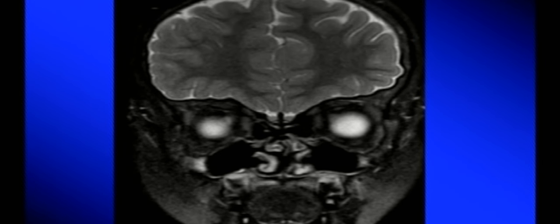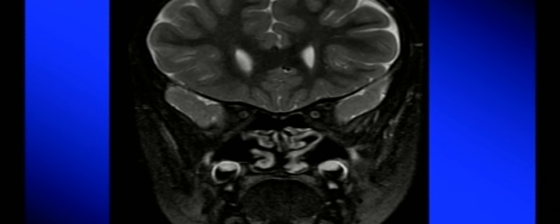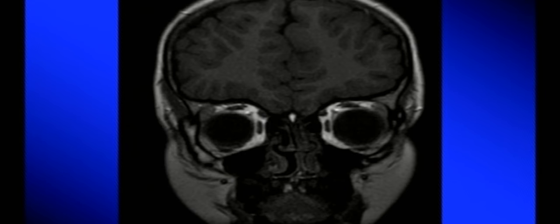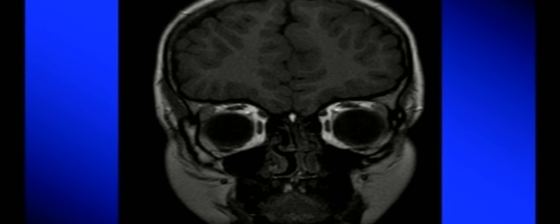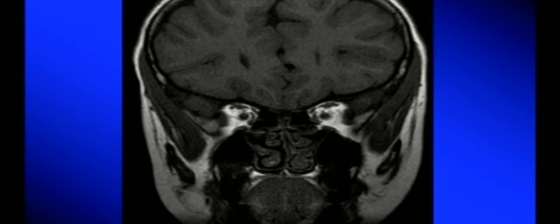Moving posteriorly on coronal sections, the eyeball disappears and we start seeing the optic nerve — surrounded by hyperintense signal because the meninges surrounding the optic nerve contain CSF, which is fluid and therefore hyperintense on T2. On T1 coronal sections, the vitreous is dark and the orbital fat and muscles are well identified. On T2 images the vitreous is bright.